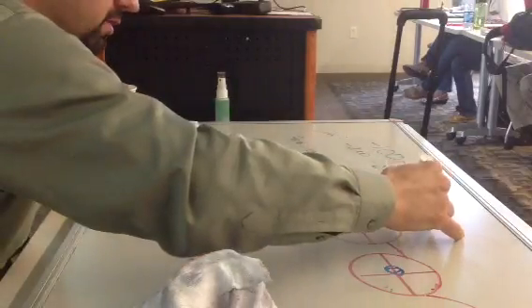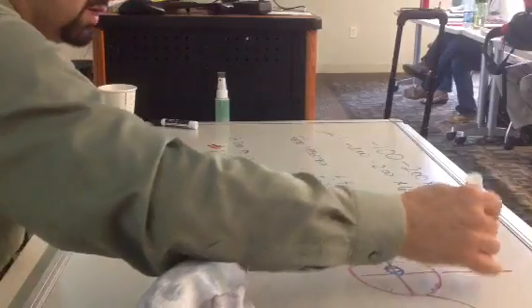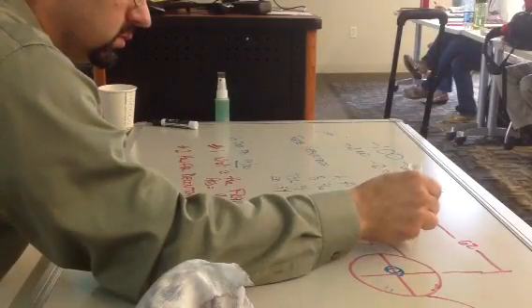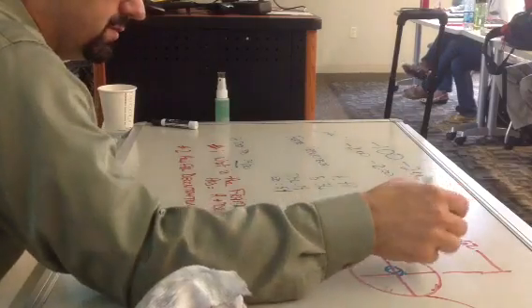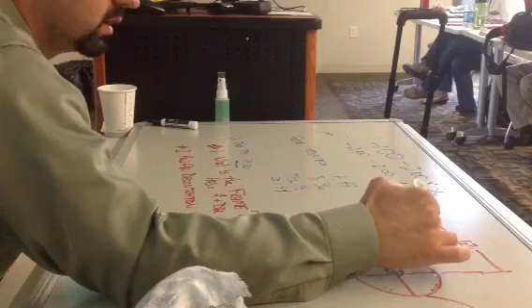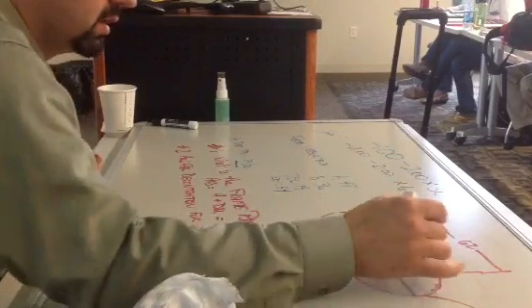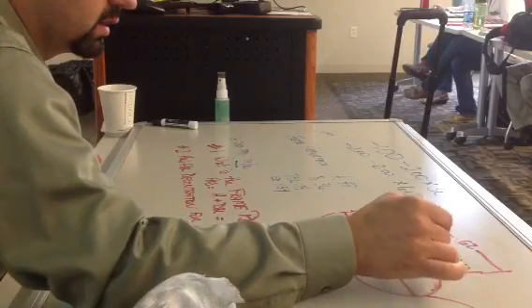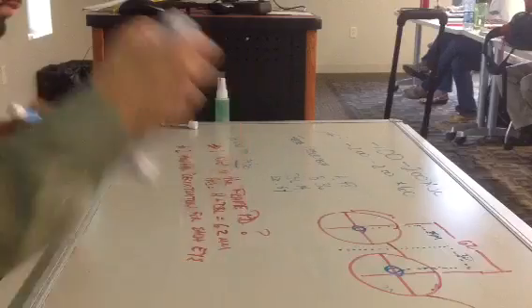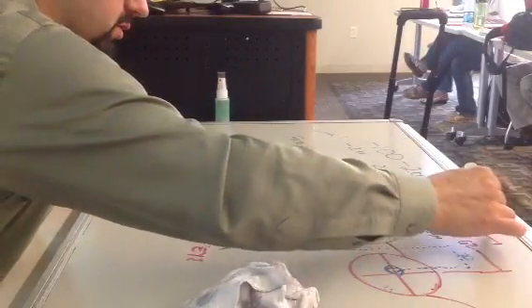Plus 14, from here to here is 62 millimeters, center to center. And then the patient's PD is 59 total, but we're actually going to break it down individually. The right eye is 29 millimeters, the left eye is 30. And center to center, 31.